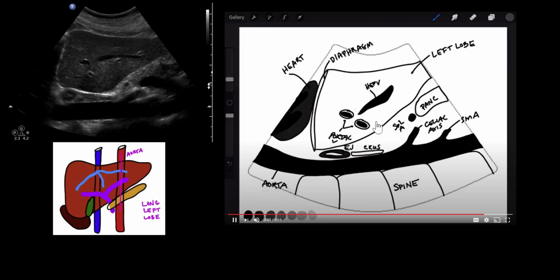Again, if you are unable to, we can do the same thing that we did for the lateral and slide inferiorly on the patient, staying in the same plane. The other structures within this image, such as the pancreas and the esophageal junction, are important to be able to recognize in the event that something appears abnormal, but are not necessary to show in this image.